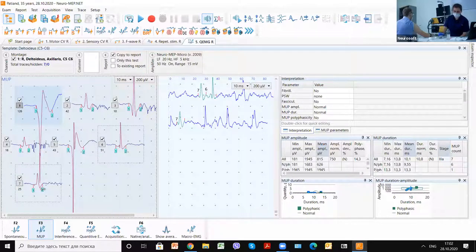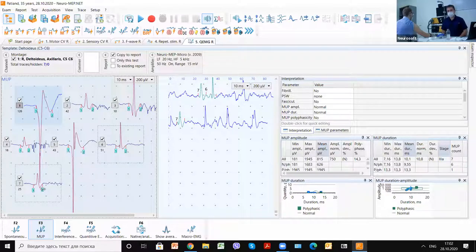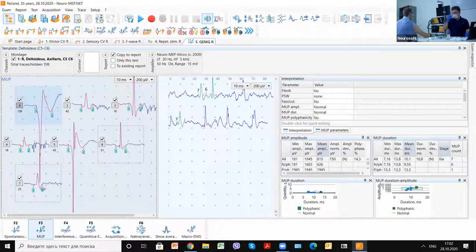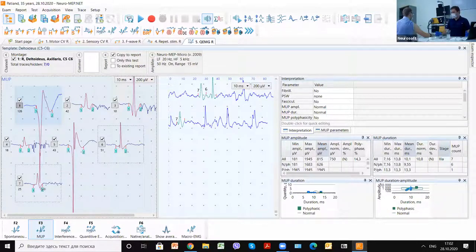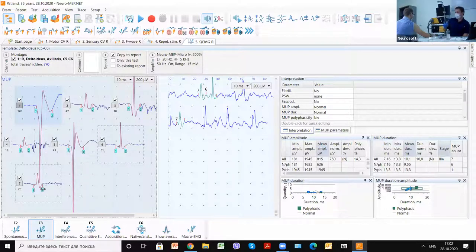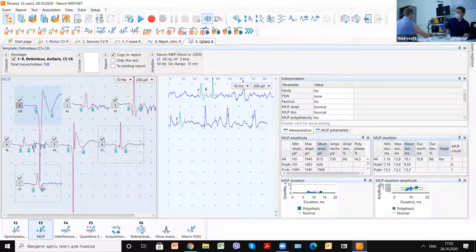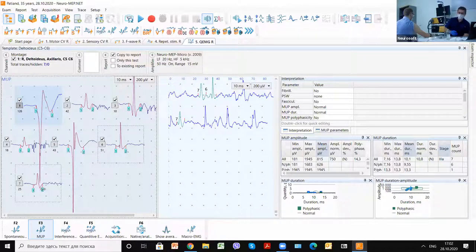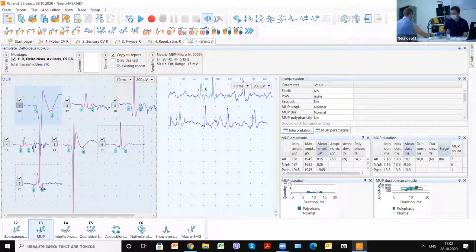Also, sometimes it's possible to perform quick EMG because in some situations, for example acute trauma or something, we should not get all 20 motor unit potentials. We perform quick EMG with different muscles with short time.